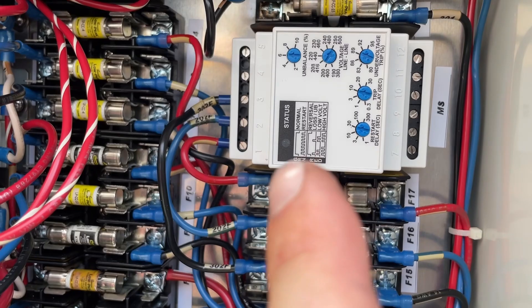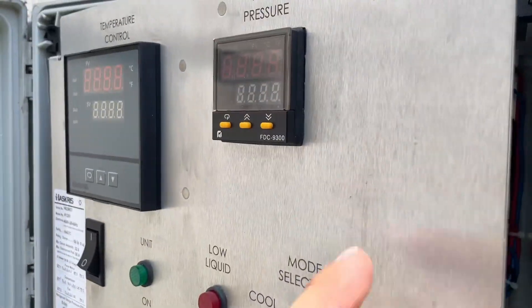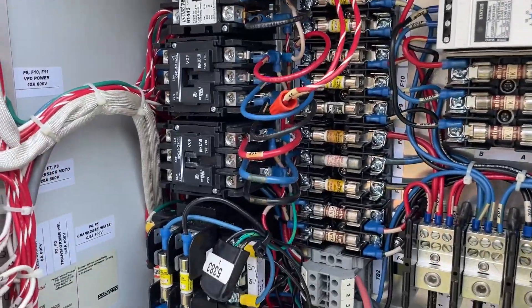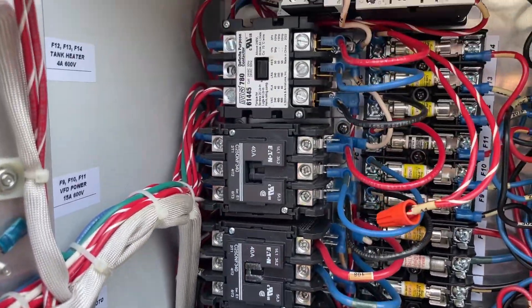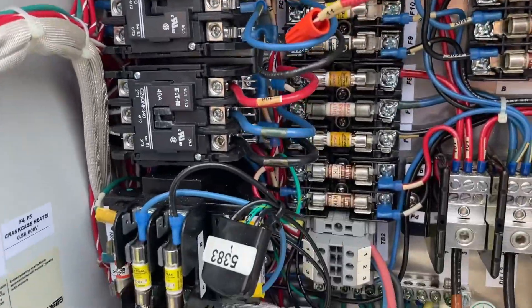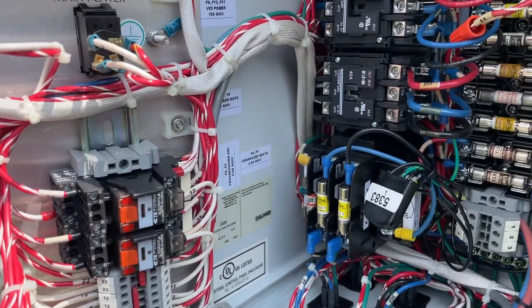One thing I noticed right off the bat is we've got no status light there. Because this display is also blank, it's starting to make me wonder if we're missing a transformer somewhere — low voltage. Let me get into it.